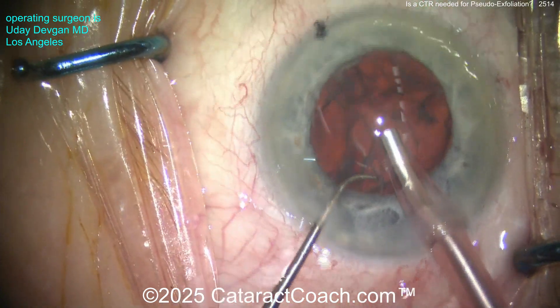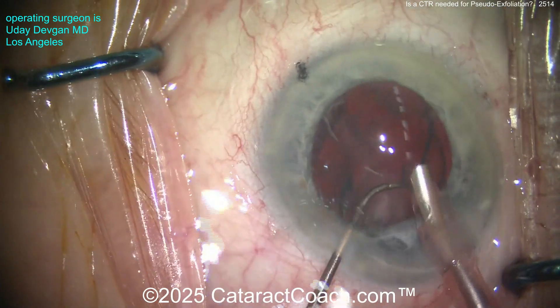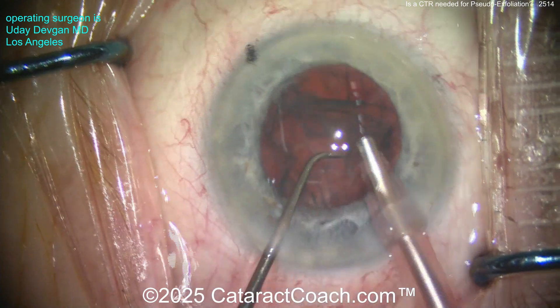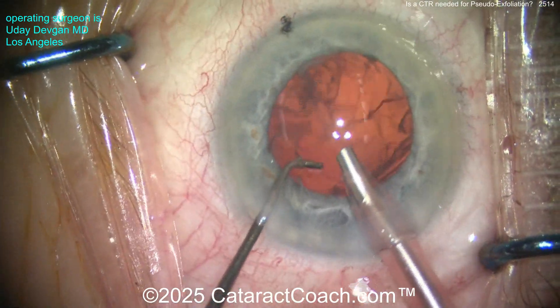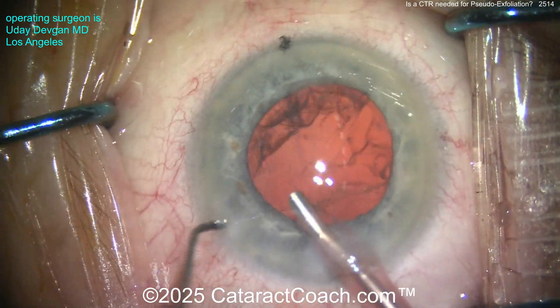The nucleus comes out very efficiently. Now getting out a little more lens material — the epinuclear shell. Can we get that flipped over with the chopper? There you go — get it flipped, and now take that epinuclear shell down. A tiny little piece here — take that out.